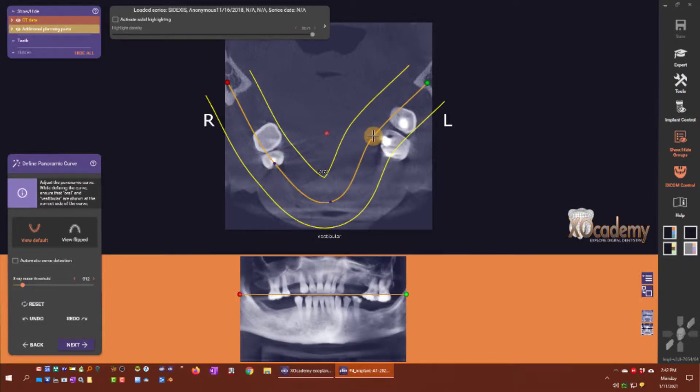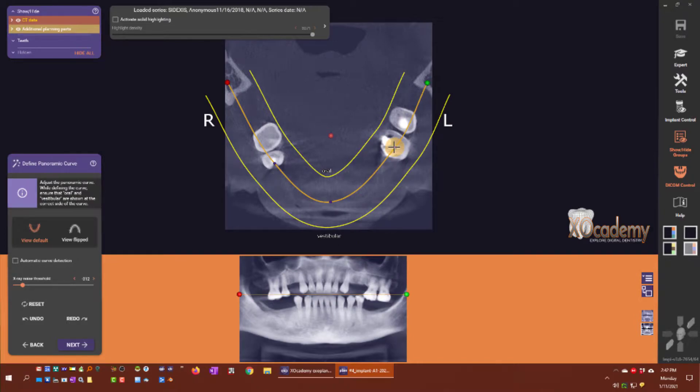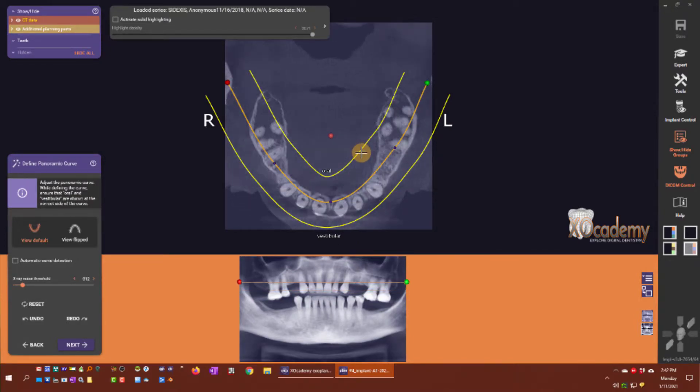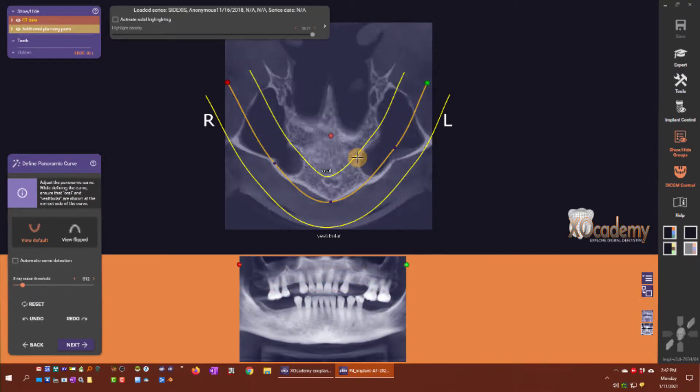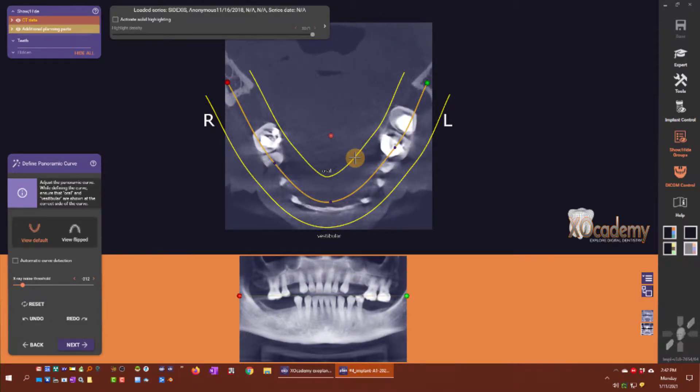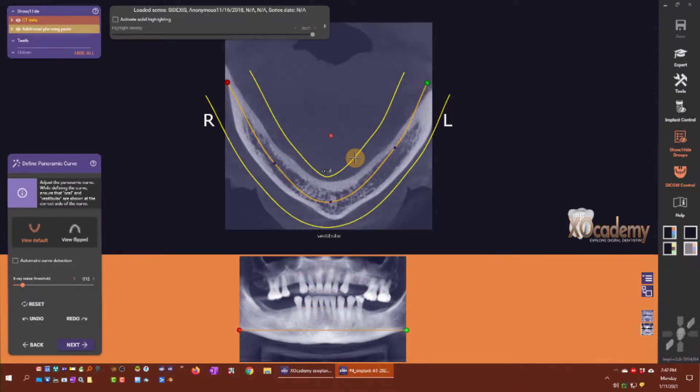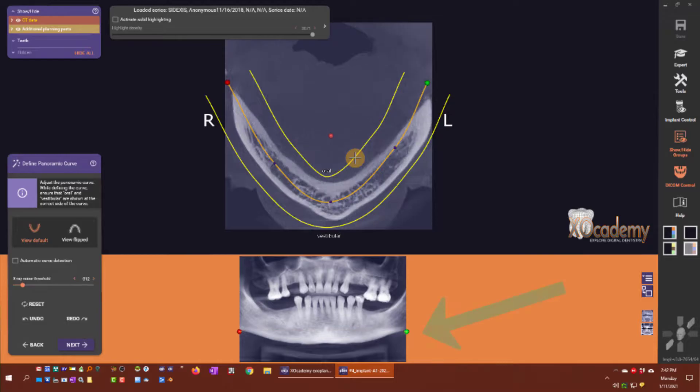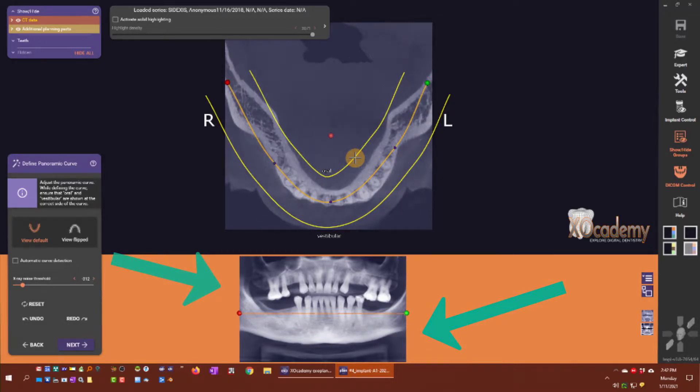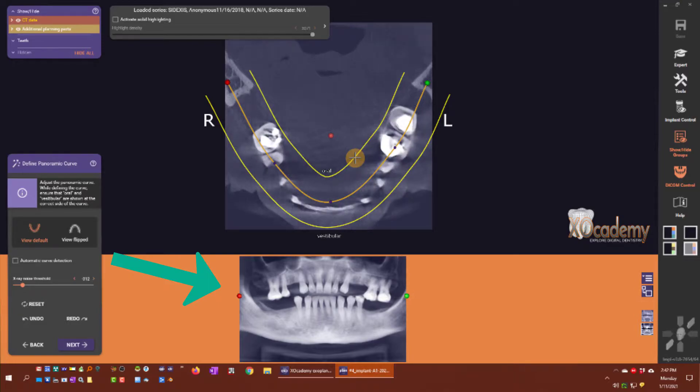When I use my mouse wheel, I can move that line, the curve, axially. So you see now it's at the bottom border of the mandible, now it's kind of at the occlusal plane.